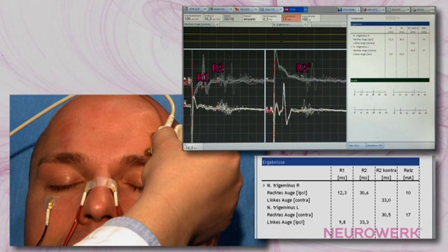We recommend that approximately 10 reflex responses of each stimulation site are recorded, which are illustrated in a superimposed manner. It consists of an ipsilateral early monosynaptic and late polysynaptic reflex response. On the respective contralateral side, only the late polysynaptic reflex response can be obtained.